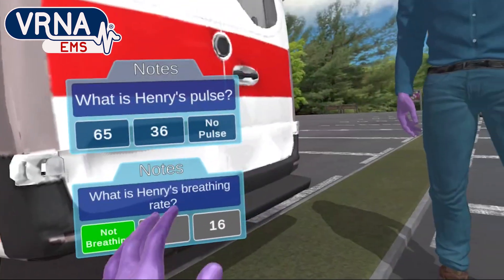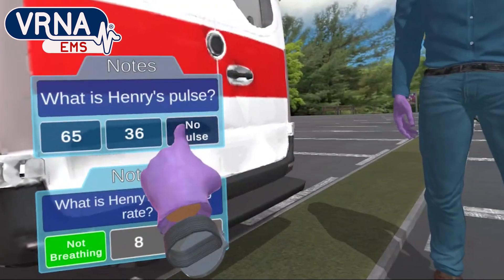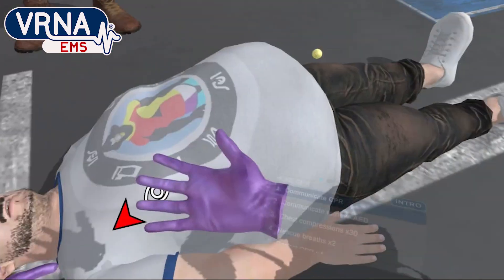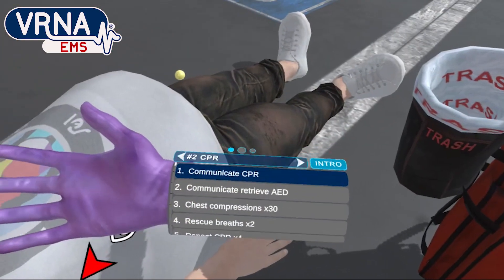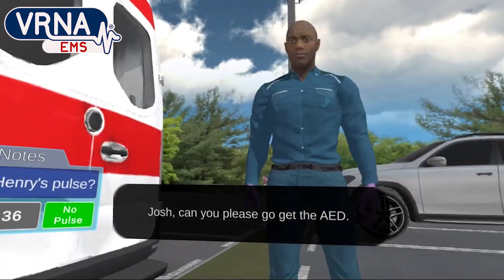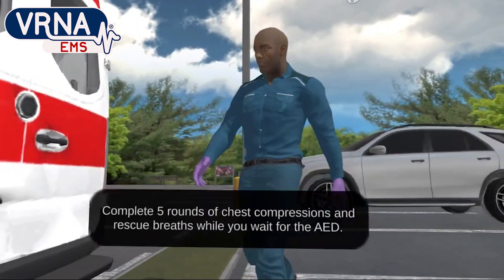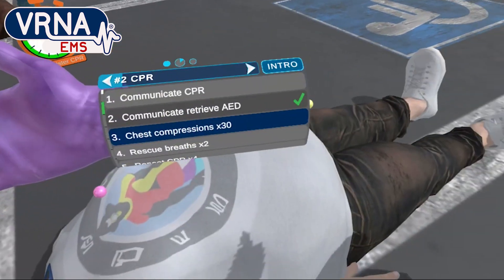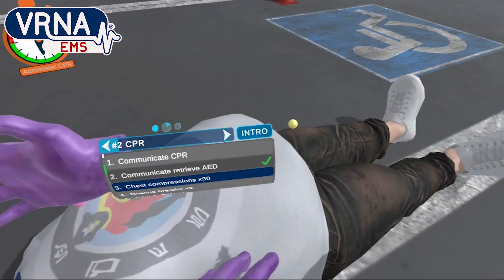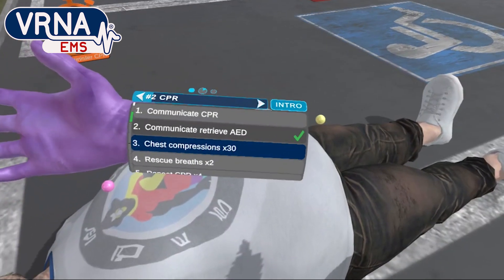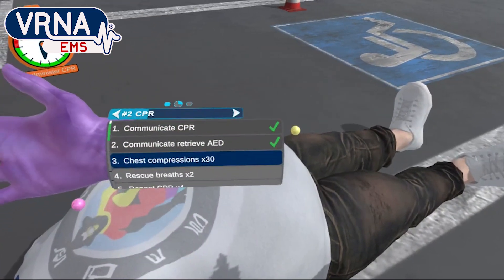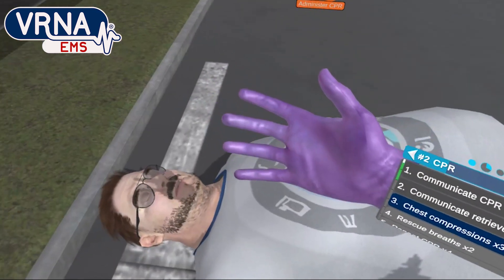Correct. Josh, can you please go get the AED? Complete five rounds of chest compressions and rescue breaths while you wait for the AED. I'm going to start CPR on you now, Henry.